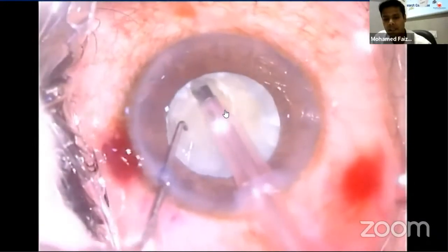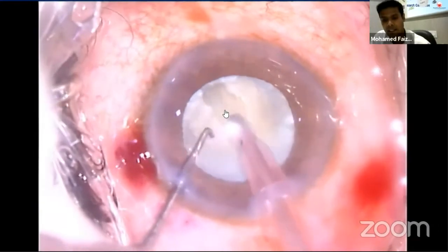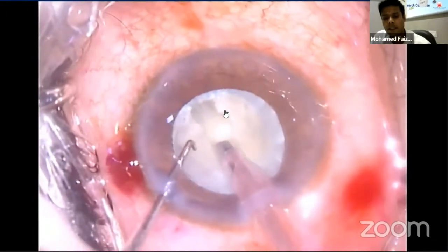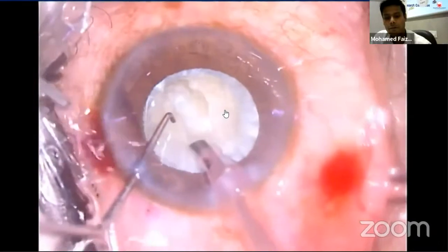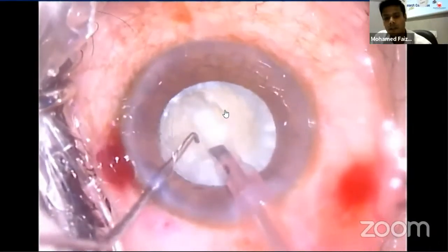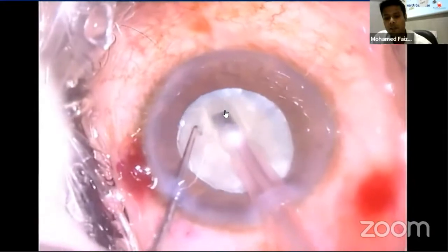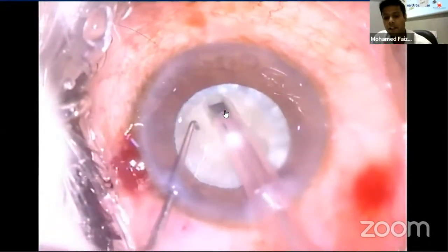During each sculpting motion, the morphology of the lens should be kept in mind: downslope sculpting initially should be followed by upslope sculpting beyond the center of the nucleus. Ultrasound power should be used only during forward movement of the tip, and the foot pedal should return to position 1 during reverse movement. On the distal side, the nucleus can be sculpted slightly further towards the periphery, but under the site of the entry wound the groove cannot extend as far peripherally due to the capsular ring and the angulation of the FACO tip.